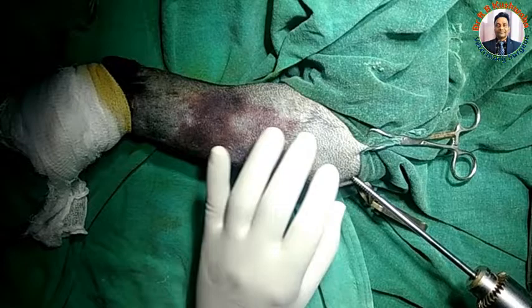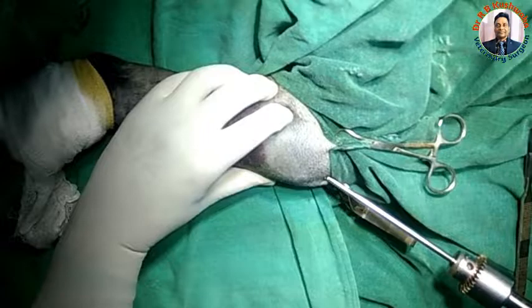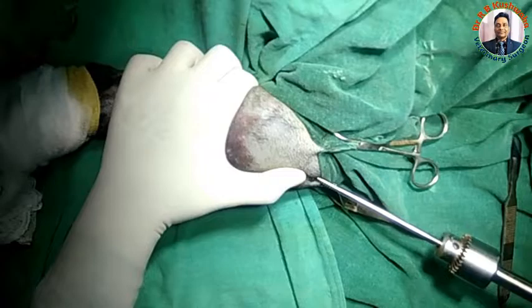I have already measured the diameter of the medullary cavity. This is approximately 8 mm.